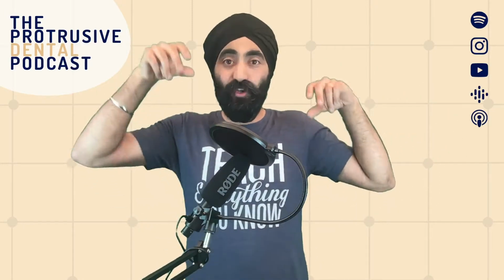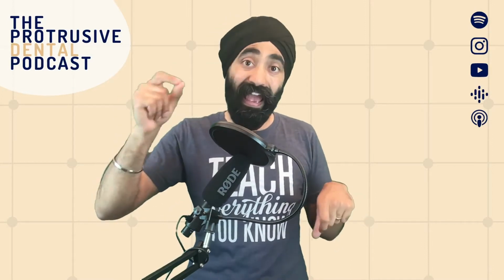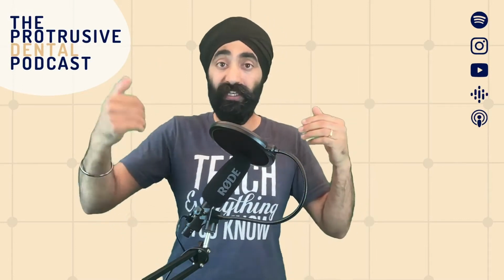So when you take out your bisacryl temporary and you just about prise it out, sometimes maybe you get a flat plastic and you bring it out. Now the first thing I would do is I will get either a Sharpie pen or an indelible pencil and color in a small circle, maybe about 2-3 millimeters mesial and distal, okay, of where my contact area is, where it's contacting the mesial and the distal tooth.